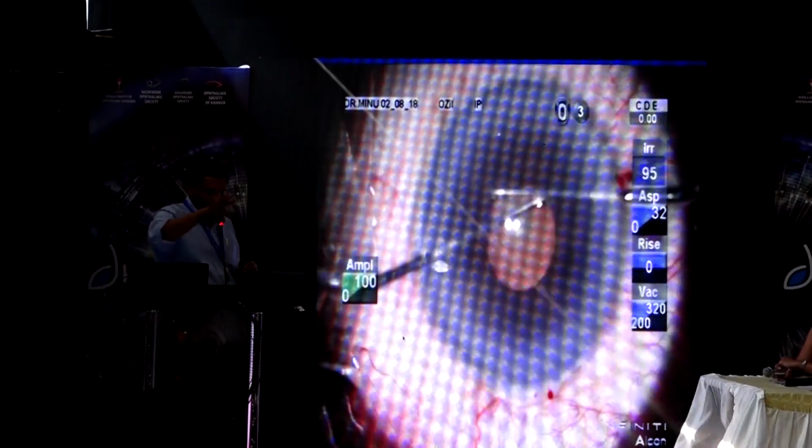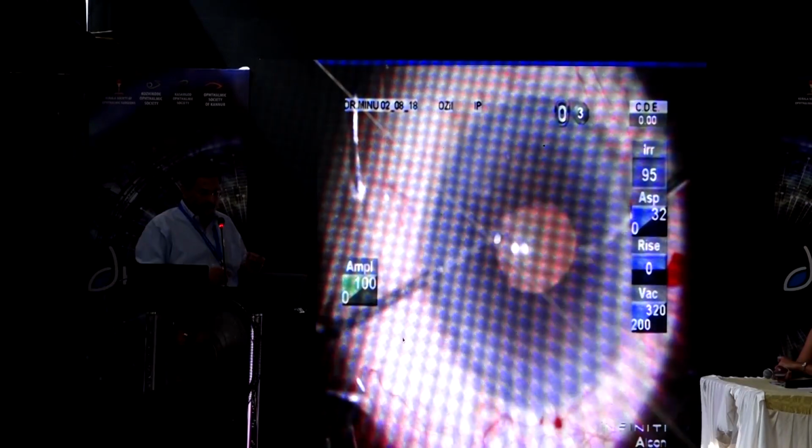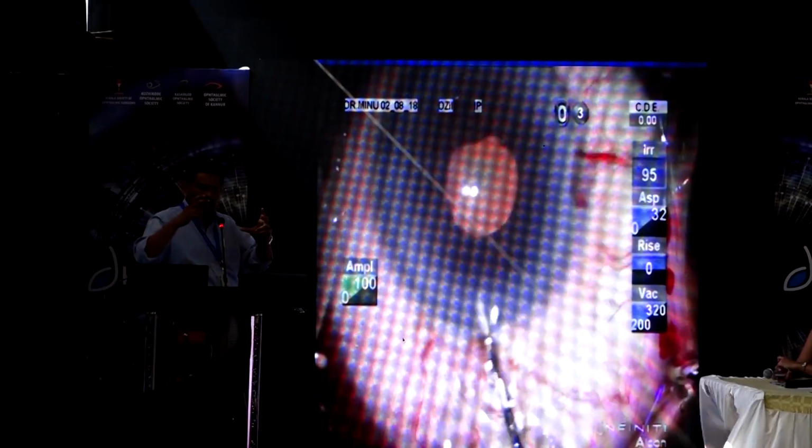So this is the uveitic one, the classical one, which ideally has to be separated. You identify, sometimes the attachment will not be just at the pupillary margin. It will be broad based, the iris will be fully stuck. So push visco all along so that it goes underneath the iris and releases the whole thing. And then give it a small stretch, because these are very rigid ones.